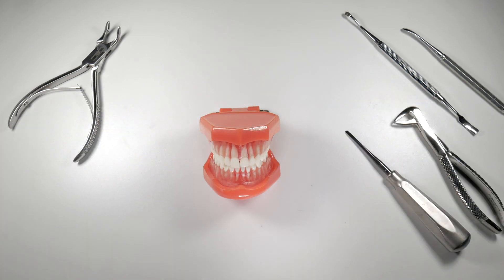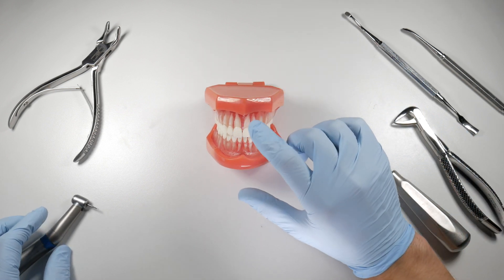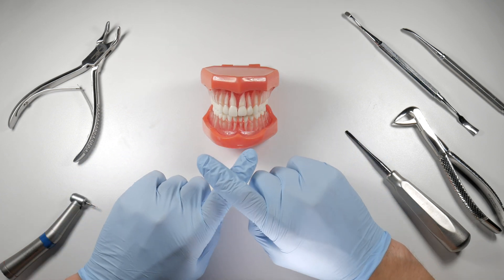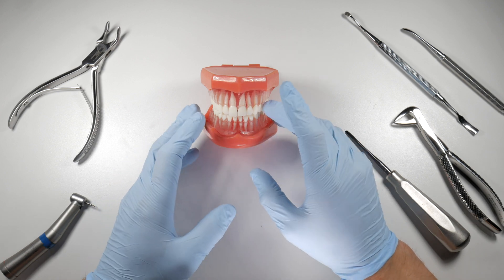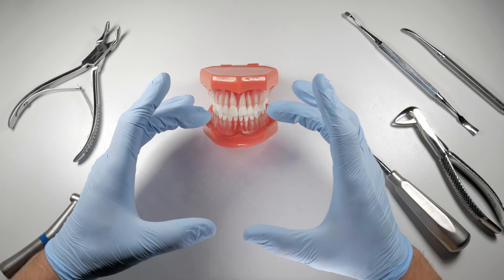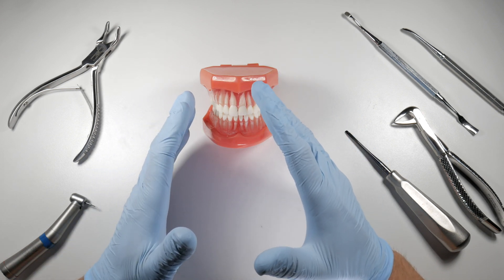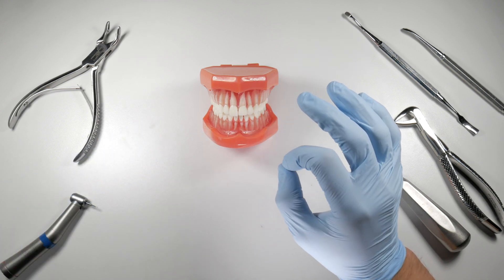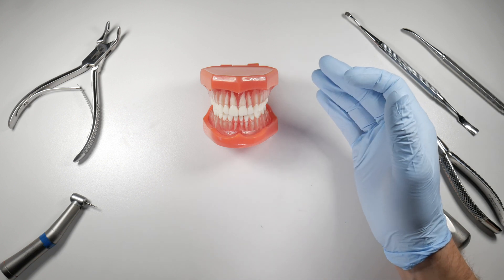Once you've managed to get the bone off the tooth, place a suture — not necessarily because you need to close the extraction site, but to stabilize the bone. Use a figure-of-eight suture or a horizontal mattress suture, something very firm and rigid, to hold that plate in place so it's not mobile as it heals. This gives you the best chance of the bone integrating with the surrounding bone rather than being rejected.